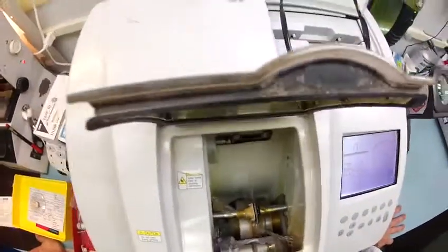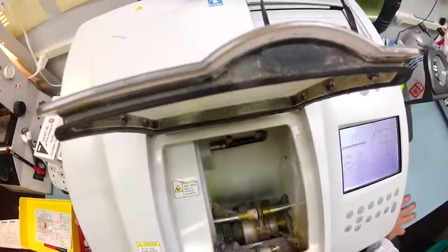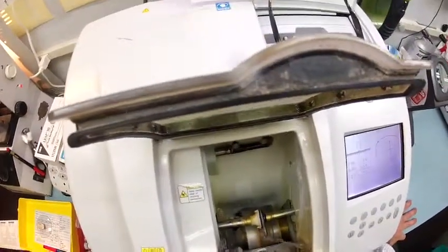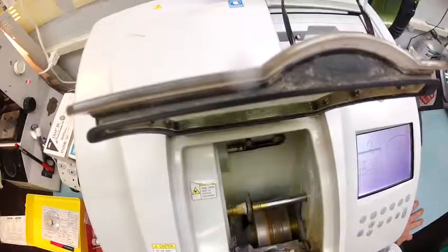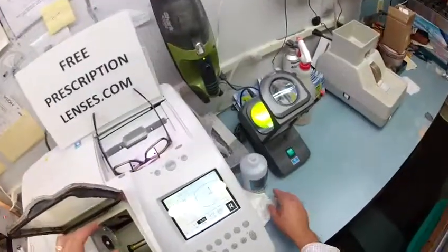This will be done in just a moment, and I'll take it out and see if it will fit. Honestly, I'll actually be skeptical that it'll fit first time around. I programmed my machine to cut a little bit larger, just because the golden rule: you can always cut more off of a lens, you can never add it back on. So I start a little bit large, and once I get the correct size for the right, I will flip it over and cut the left.